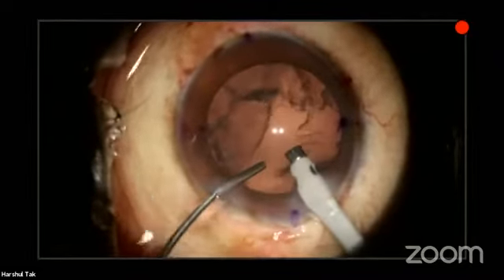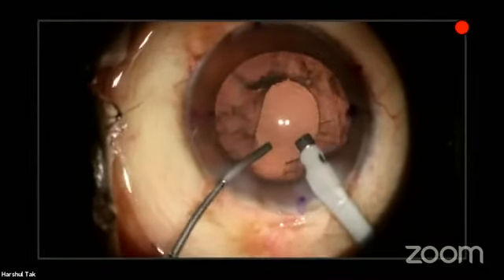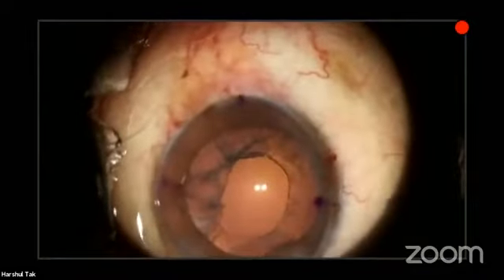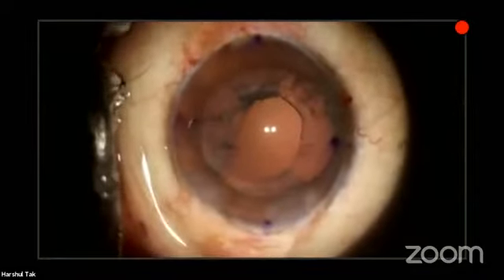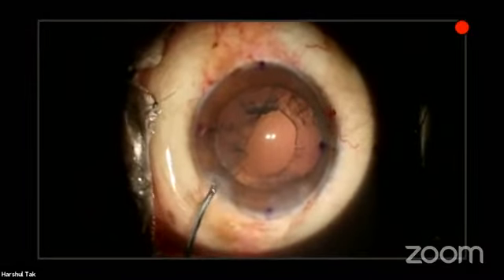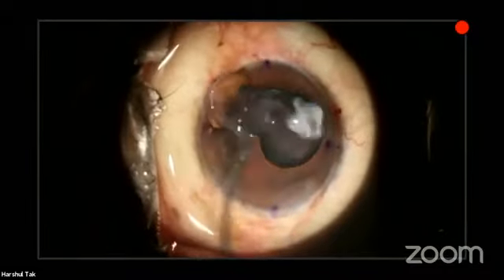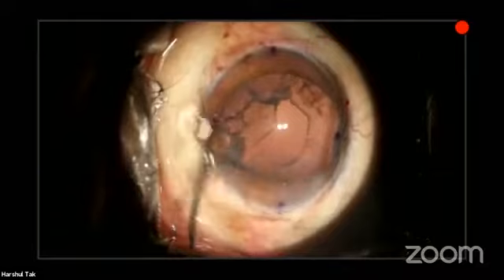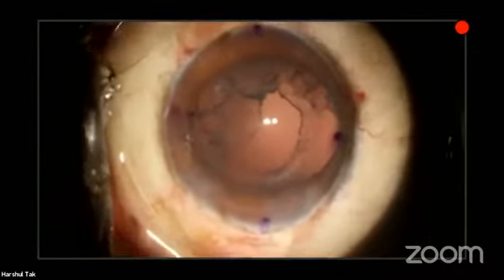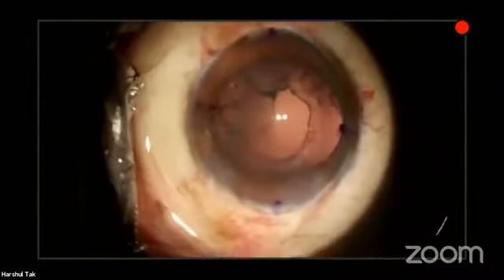I'm putting viscoelastic. This is a modified viscoelastic cannula which I have designed. It is a 23 gauge, 25 gauge cannula. It goes through the side port easily. You can make out it has a curve like this. It's easier to reach different places wherever you need. And it has a screwing type of system, so you need to screw it up. But see the light mein dekhenge, bahut acha hai na.